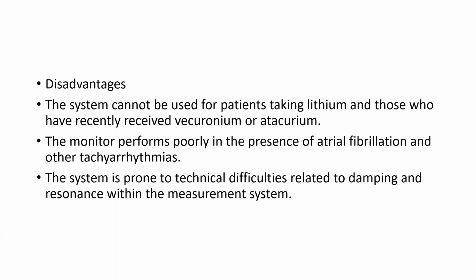Now, disadvantages: the system cannot be used for patients taking lithium and those who have recently received vecuronium and atracurium. The monitor performs poorly in the presence of atrial fibrillation and other tachyarrhythmias. The system is prone to technical difficulties related to damping and resonance within the measurement system.